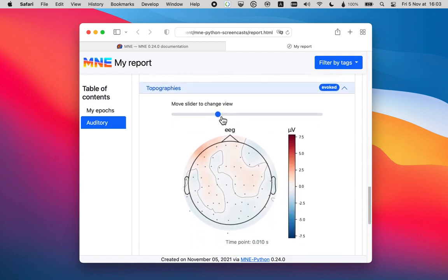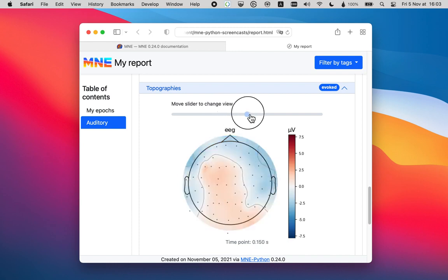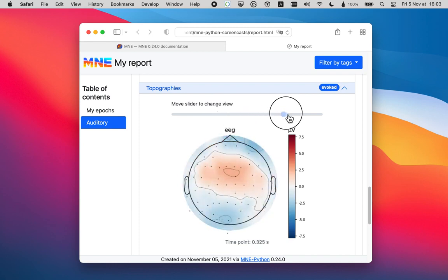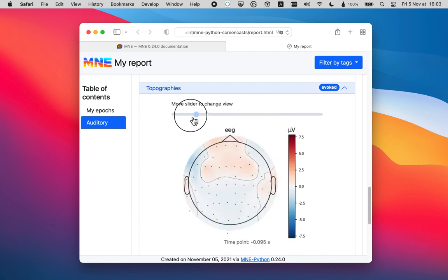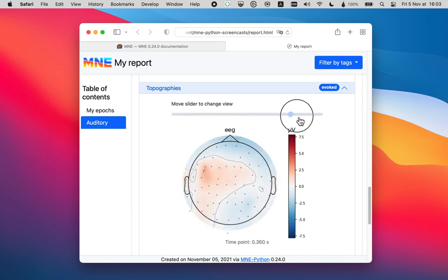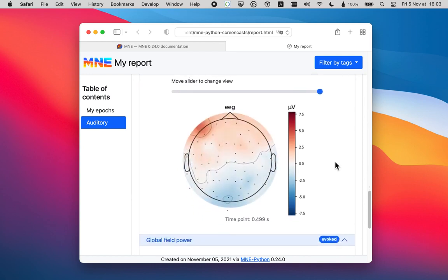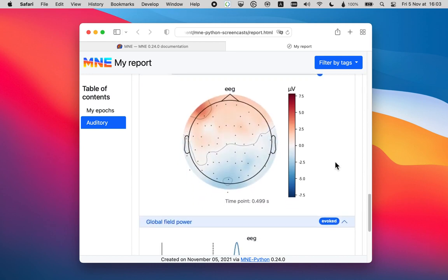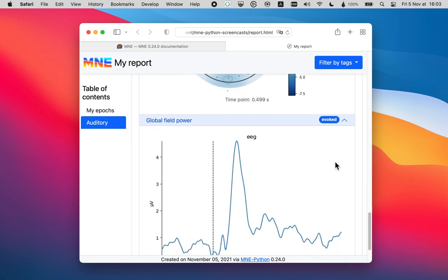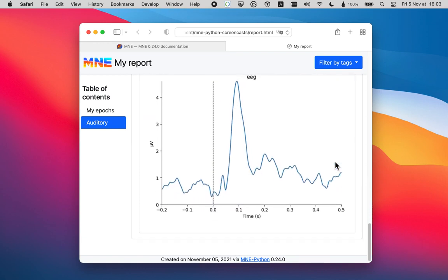And we actually have a time slider here. It allows us to view the topography at different time points. By default, these are, I think, 21. And you can also change the number of time points to display. And of course, the GFP.